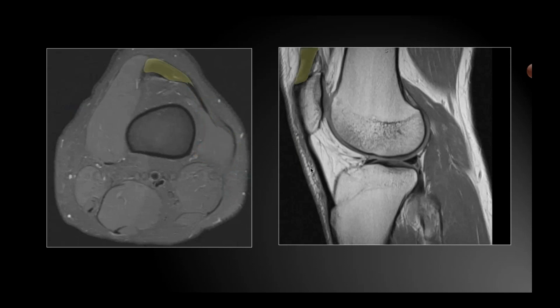Moving on. All right, next structure here.